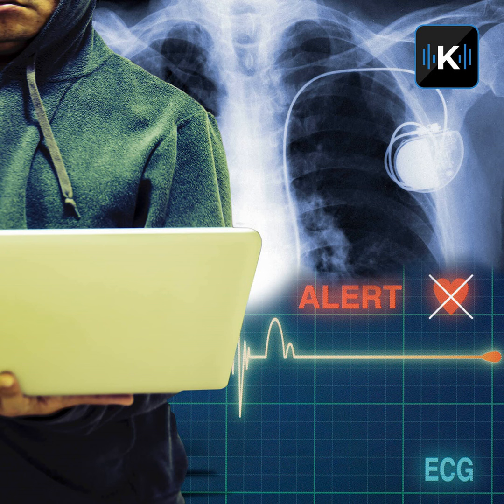The survey also showed that more than half of the engineers have to physically examine the device before they're allowed to schedule repairs. Okay. A lot of times, there's a patient attached to that device, and if that's the case, exams are a no-go. They have to try again sometime in the future, just hoping for better luck.